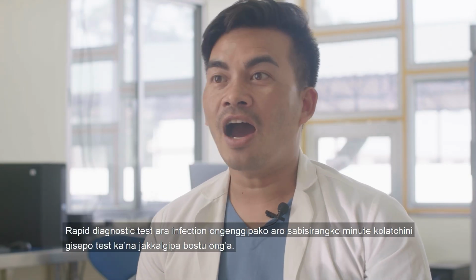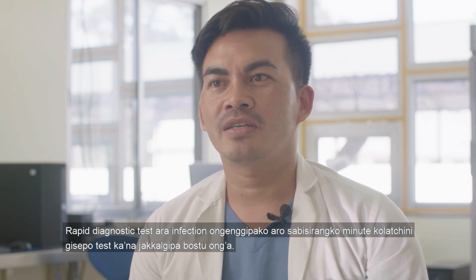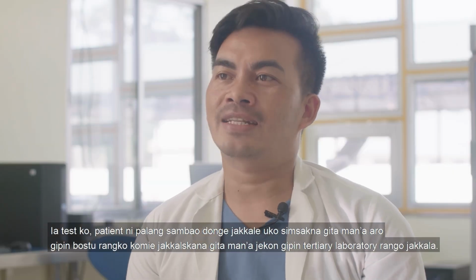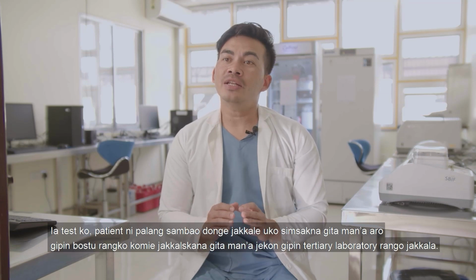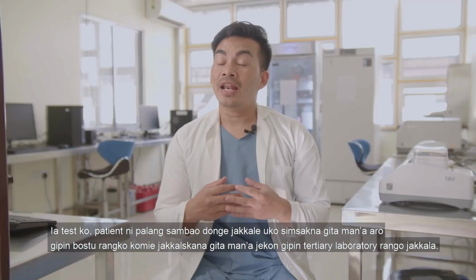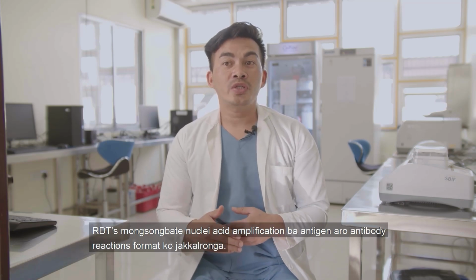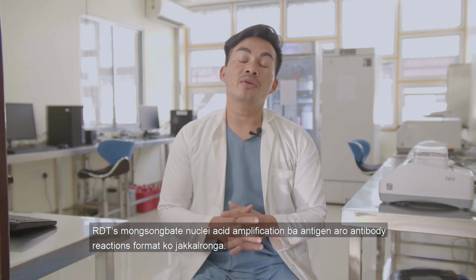Rapid diagnostic tests are, as the name suggests, kits that are used for diagnosing infections or diseases within a short time period, usually within 30 minutes. They are used in point of care settings, that is, directly at the bedside of the patient, having minimal need of other requirements such as equipment and other consumables that are usually available in the tertiary level laboratory. RDTs usually use the format of nucleic acid amplification or antigen and antibody reactions.